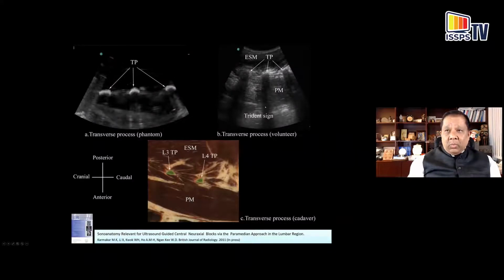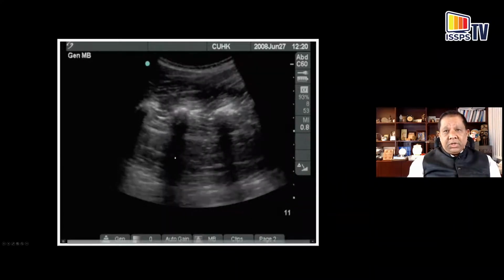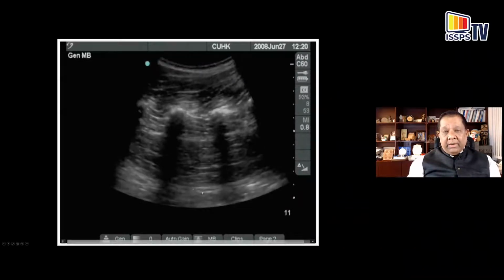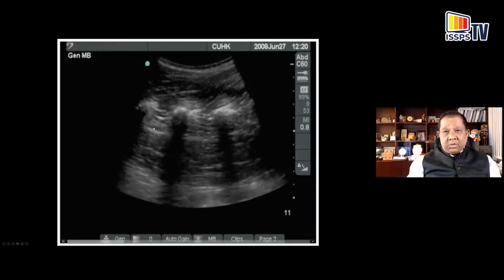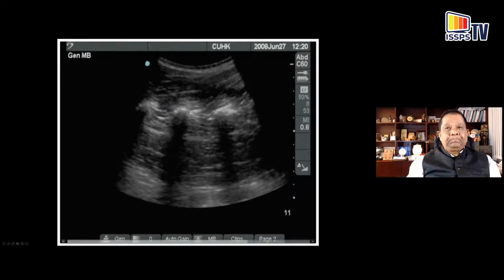And in the acoustic window of this lumbar ultrasound Trident, you can see the psoas muscle, which is located in this Trident here. So let's take a look at this video image where you can see the acoustic shadows of the lumbar transverse processes. In the acoustic window, you can see the psoas muscle. You can also see the anterior border of the psoas muscle, which is this hyperechoic area. Anterior to that would be the retroperitoneal structures. Thereafter, you can look at the posterior part of the psoas muscle. You can see here there's a hyperechogenic line, which represents the lumbar plexus nerves in this particular subject.